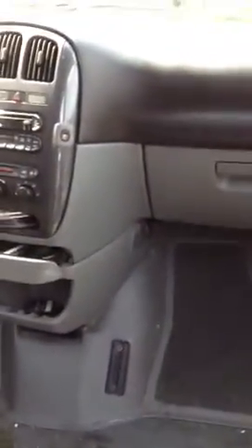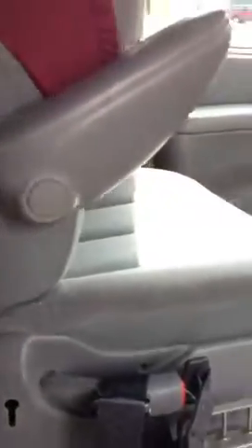My van was tailored so that I could get my husband's wheelchair and a scooter in there if possible. So my husband uses a Jazzy wheelchair, and our van, as you see, is mostly empty. It's not as clean as it should be right now, I apologize, but he will come up in his Jazzy chair, turn and pull in as far as he can up there. Then my seat, which I'll show you in a minute, will move back and forth. Technically, I could then bring my scooter in behind him.